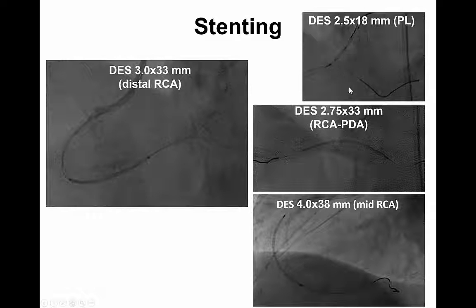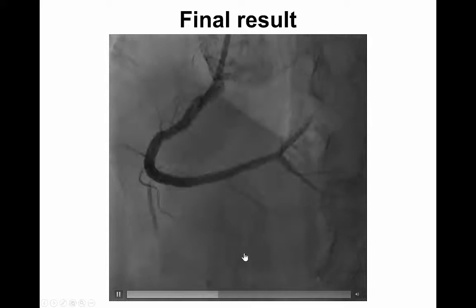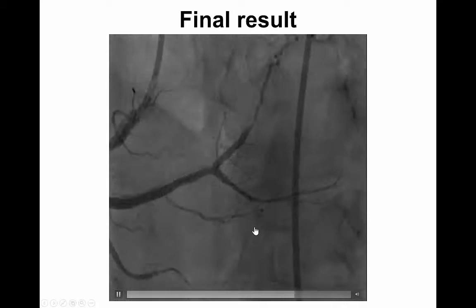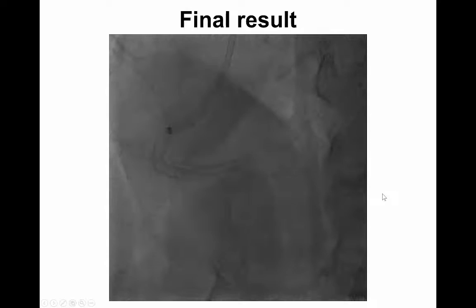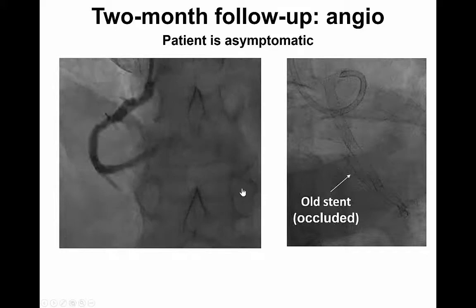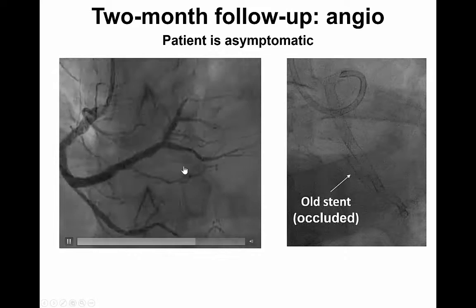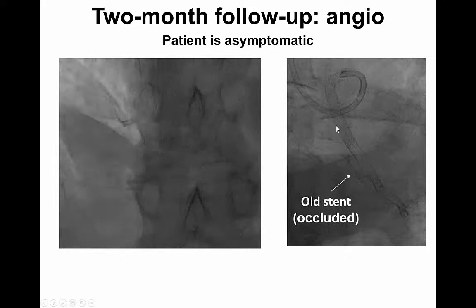We performed T and protrusion stenting across the crux and finally implanted another stent in the proximal to mid RCA. This is the final result, which is excellent. Since we were concerned about the durability of this procedure, we had the patient come back a couple of months later, and the patient was asymptomatic.